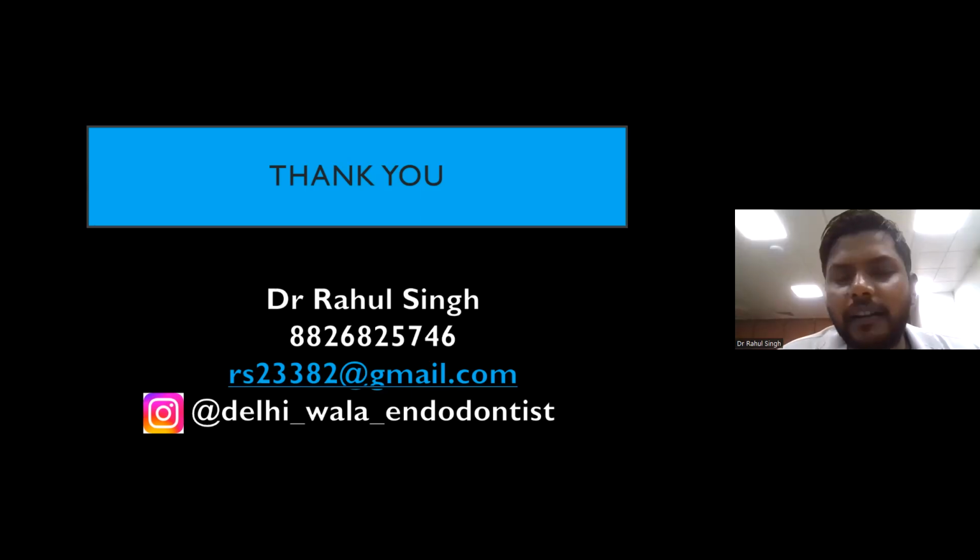What has happened is the GP will never lose its color. The only color that comes out is at the top of the GP, if you're using an F2 or an F3 ProTaper GP. So the F2 has that red marking on the top of the GP, and that comes out. But the GP will never lose its color. That red color or that blue color of the F3 ProTaper GP will come out. Rest, the GP will never lose its inherent property from NaOCl.